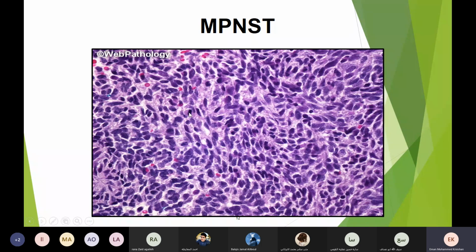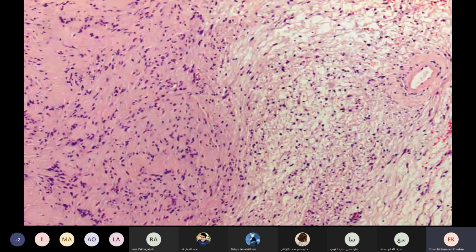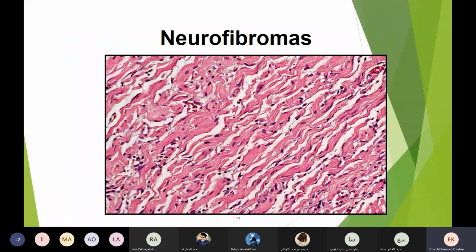And we have mitosis. This is one. This is mitosis. So high mitosis, hypercellularity, areas of necrosis in other parts. There's no necrosis here. And infiltrative borders. Just to remind you, the schwannomas are encapsulated while the neurofibromas are not encapsulated, unencapsulated. They are ill-defined, okay?